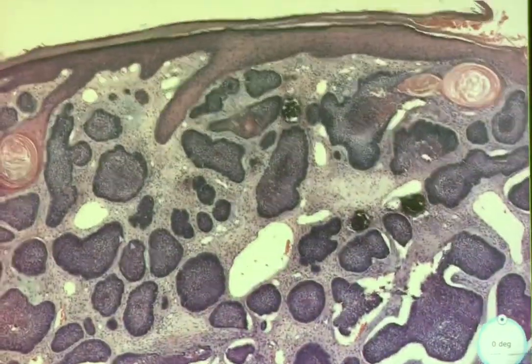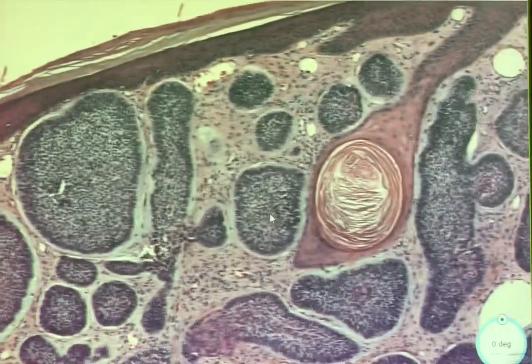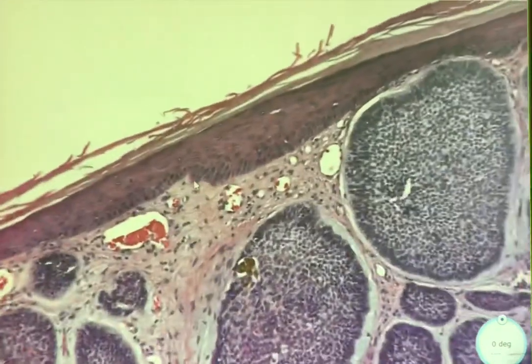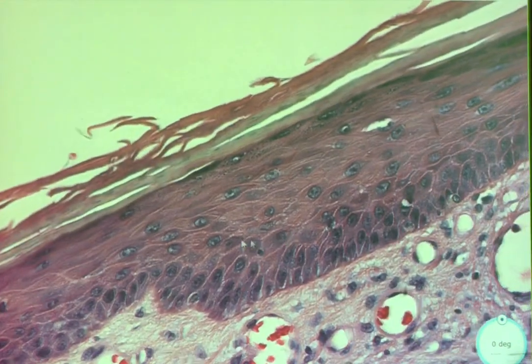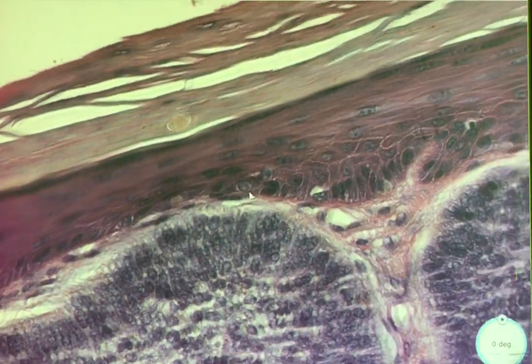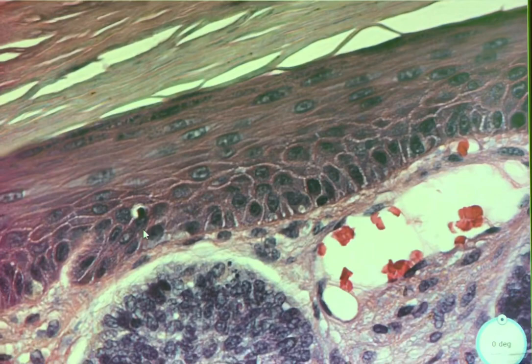And then there are so many of them. What is this? That's just some keratin. It's attached to the surface, so we're not worried about that. Well, what about the epidermis? I mean, we are in skin. What do you think about that? It does look okay. That's because it is okay. I don't see any pathology. No pathology, okay. Maybe some slight spongiosis, because there's always some spongiosis. It's like everywhere. Well, in all fairness, for anyone who's going to say there's not always spongiosis, it can be an artifact.